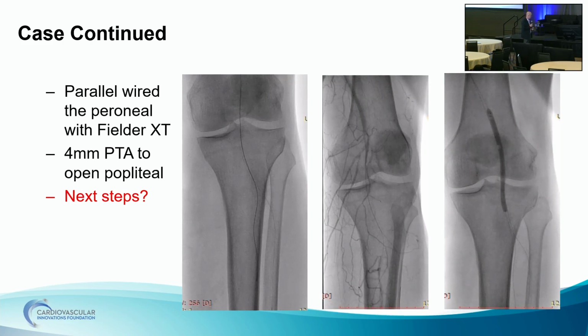I'm thinking IVL here, personally, based on that IVUS, and I agree, go low first and then work your way up. But based on that, at least a 5, if not a 5.5, maybe even a 6 at low pressure.